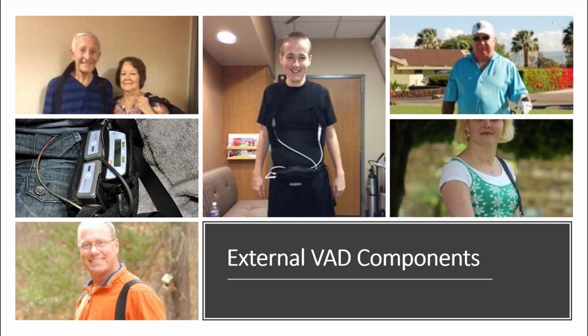So let's see what this looks like for real people. Here's a gentleman. He has his little side pack where he has the, I can't remember if that's the HeartWare or HeartMate. We see the controller and two batteries packed together. So I think this is the HeartWare.